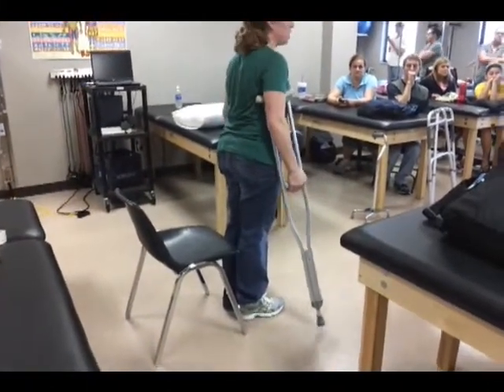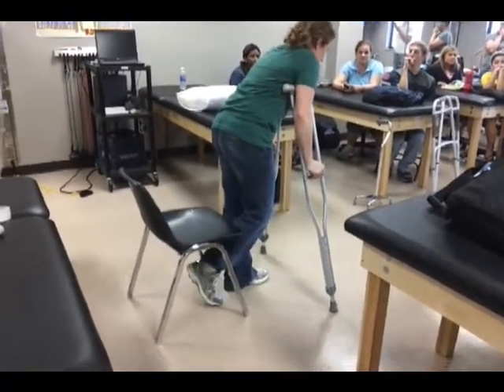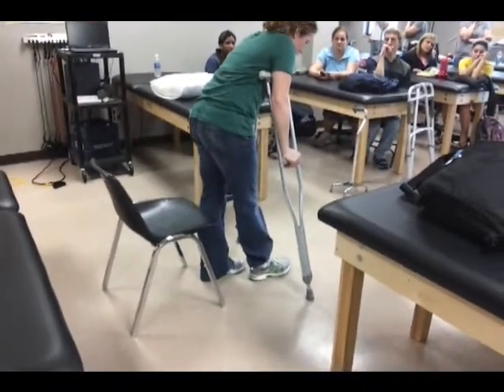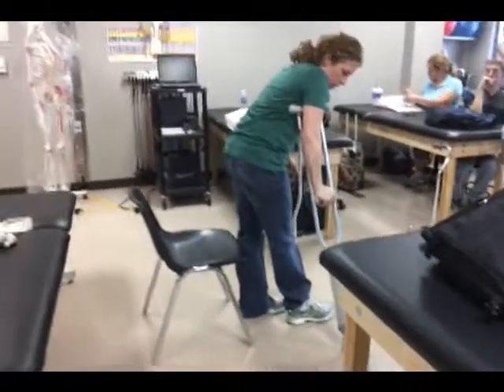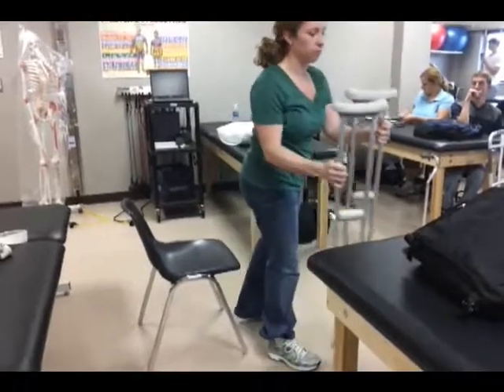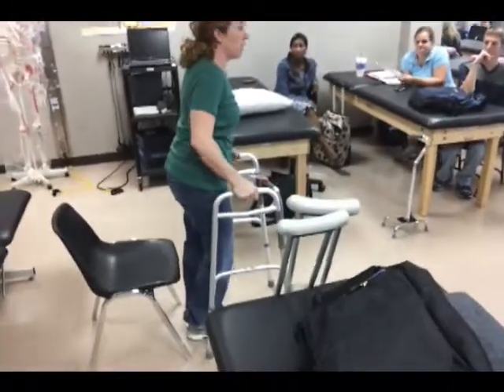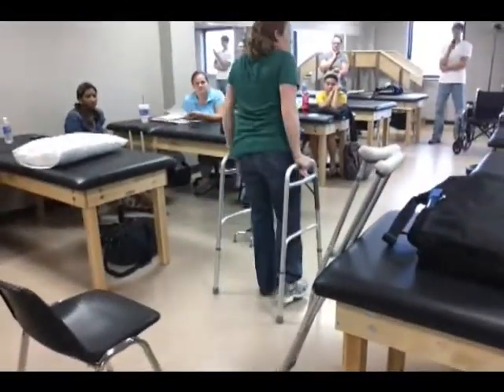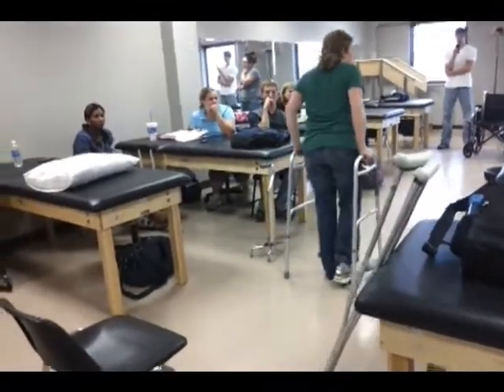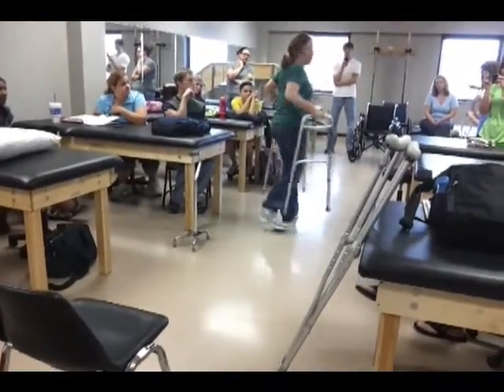If you see non-weight bearing, you're going to pick which one? 3-point. That's right. Let's hold on real quick, because I could do that with my crutches. I could also do it, if it was somebody a little older, with a walker as well. If it's an older person, are they going to feel more comfortable with crutches or a walker? A walker. So I'm still non-weight bearing, and I'm in my 3-point.